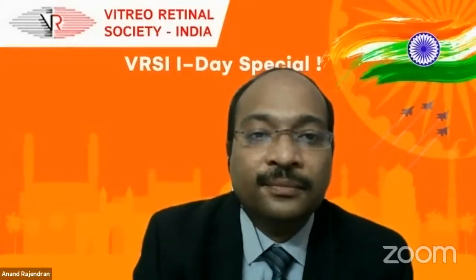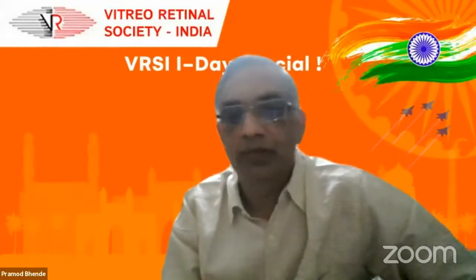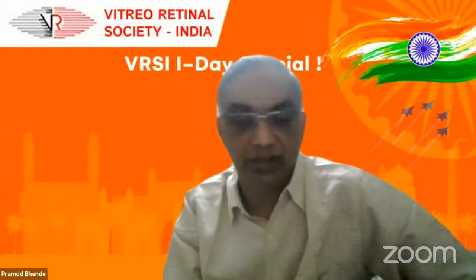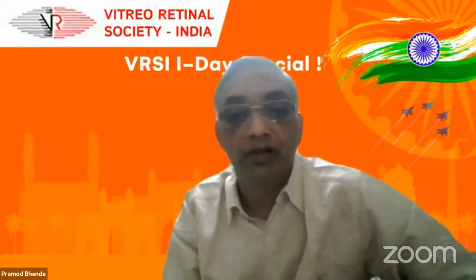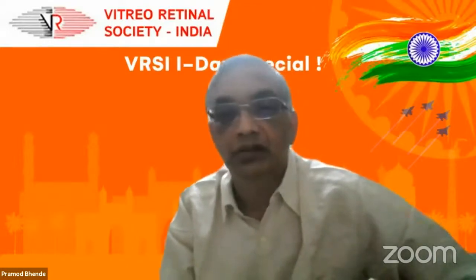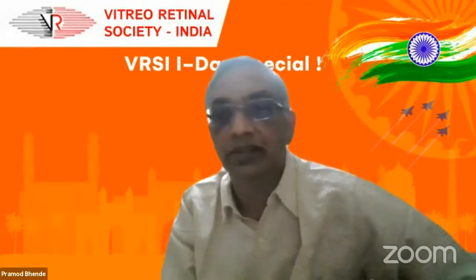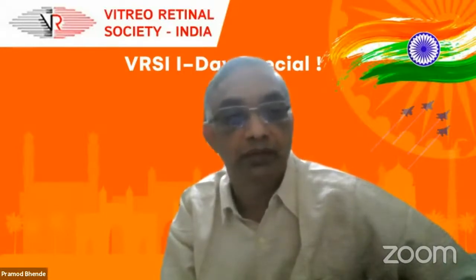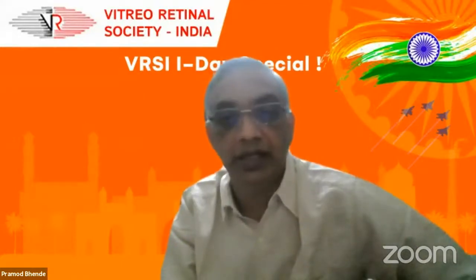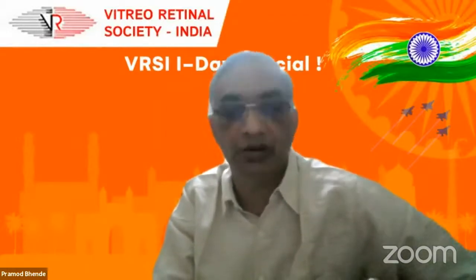This is, I think, very elegant and excellent surgery. I mean, not much to add. Basically, another problem we face sometimes is staphylomas where you have absolutely no RPE or choroid, with a break sitting right there, maybe not really a macular hole, and where you just cannot get a laser reaction. How would we handle this type of situation? ILM peeling also is not that easy. They are deep-set eyes. Reaching that area at the base of the staphyloma is very, very difficult. Sometimes you just cannot reach.